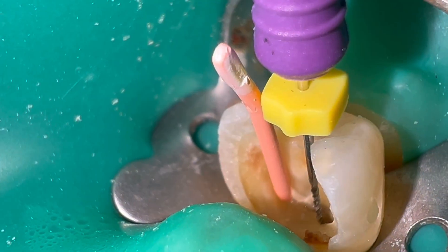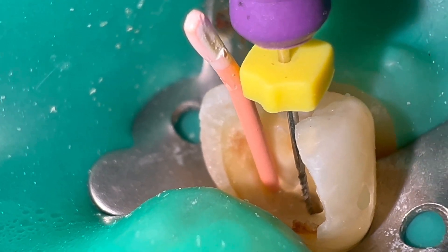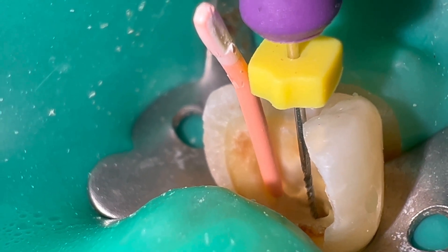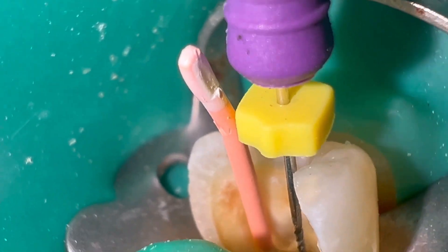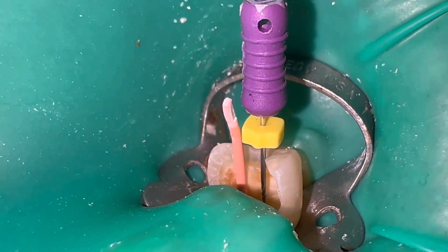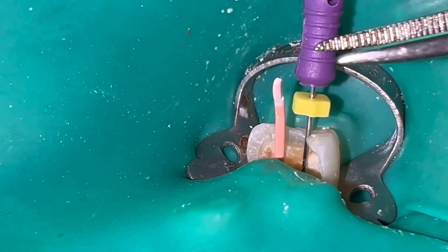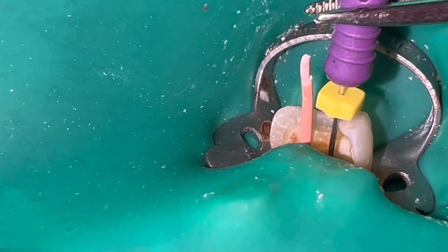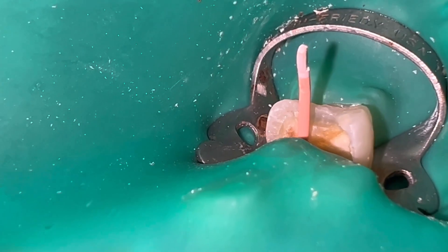The simplest canal is instrumented first. A gutta-percha cone is placed and a small caliber file is placed in the secondary canal. The confluence is detected by the scratches left by the small file on the gutta-percha cone. Now you know where the confluence is, you can adjust the working length of the files in the second canal.